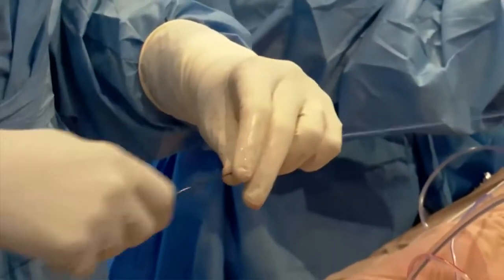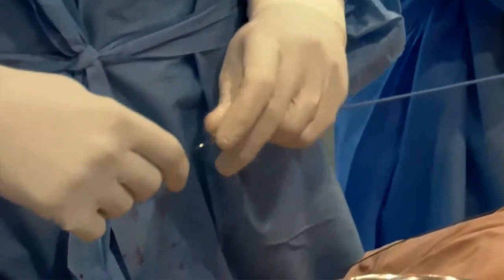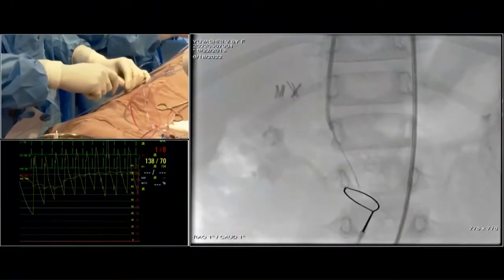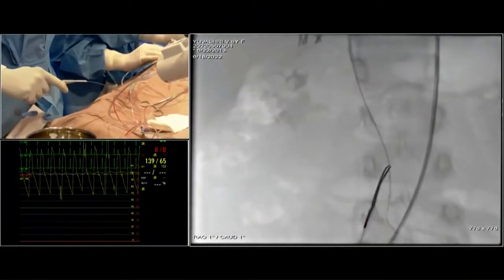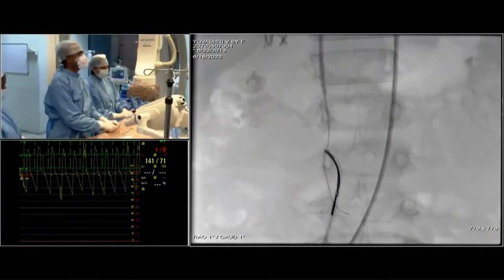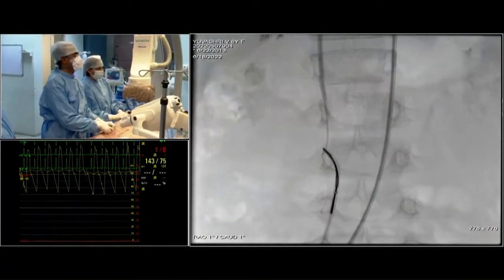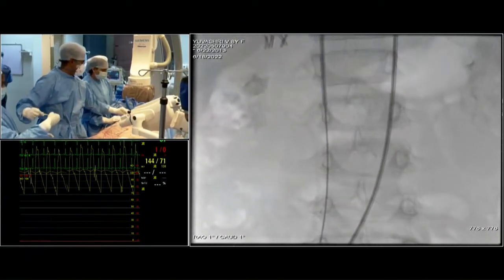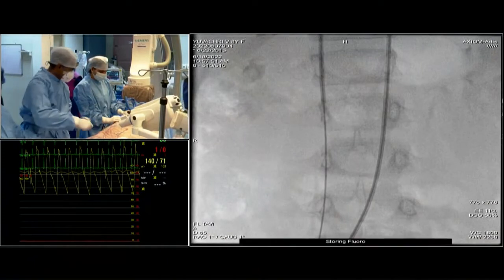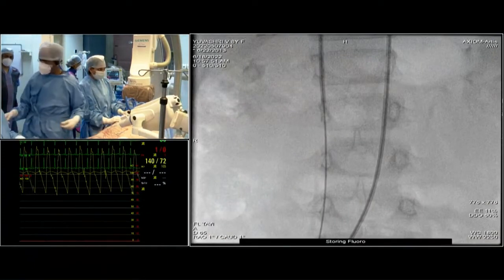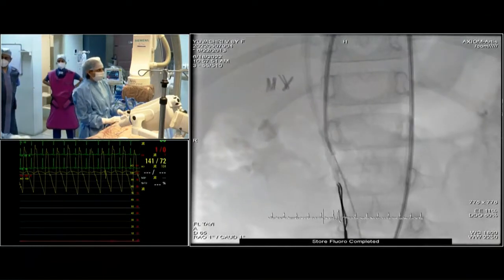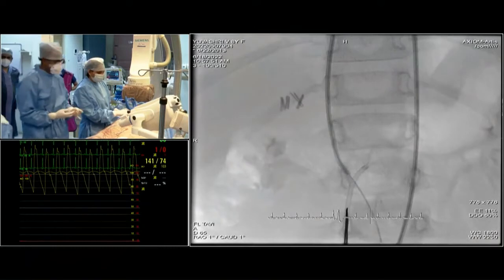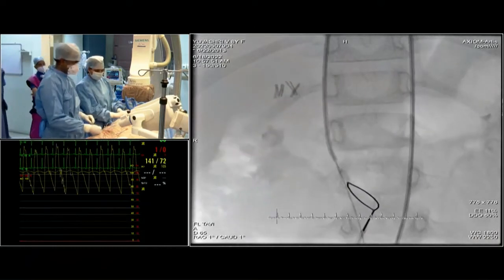We have a 15-millimeter snare and will bring the snare to the tip of the wire so we don't unnecessarily bend the distal part. Now we are pulling the snare out. We are planning to close with a 10-8 Lifetech PDA device. I am placing an artery clamp — you can use a 7 French option as well.